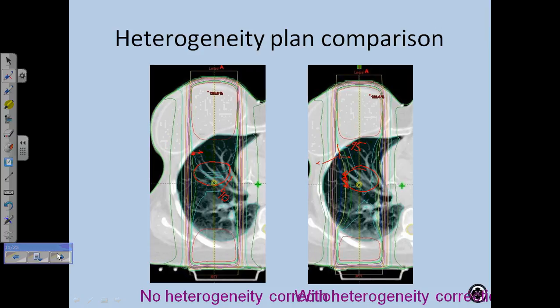And typically when you're using an APPA beam like this, with heterogeneity calculations you'll have more dose here and here. What does that say, 123.4? I can't see the numbers. But anyway, you'll tend to have a little bit more dose at Dmax because there's more penetration through the patient. Now, this is obvious when you look at an APPA beam, but once you start using multiple beams, it kind of washes out a little bit. You don't see that effect as much.